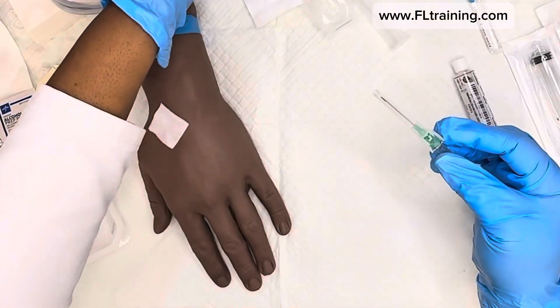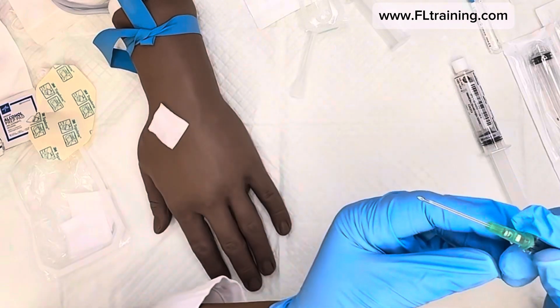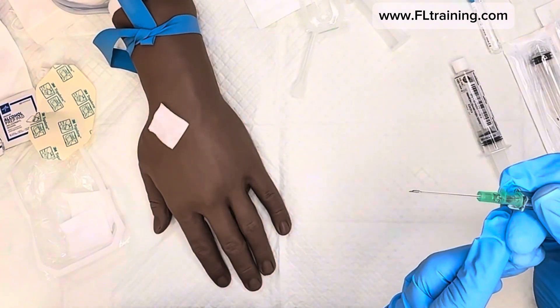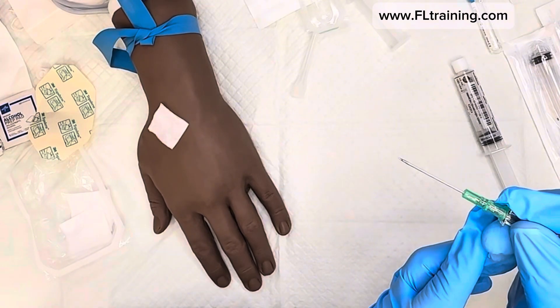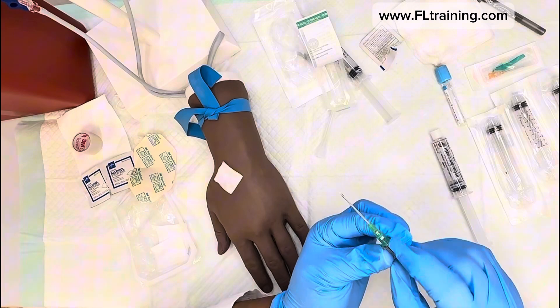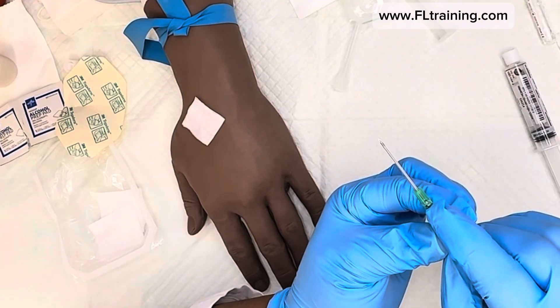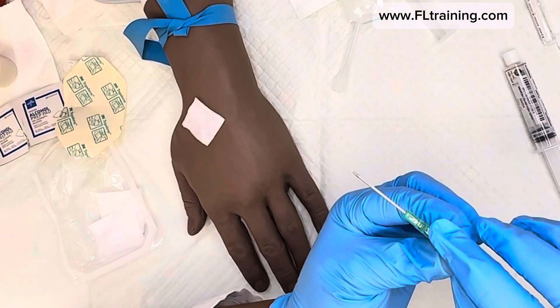Let's pull out our IV catheter. When opening the packaging, take off the protective covering. Whenever you insert your needle, it is bevel up — the sharp end is toward the skin and the bevel, or opening of the needle, is facing up. There's a little area here that helps you advance your catheter.